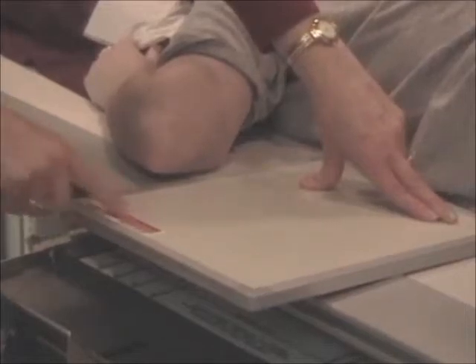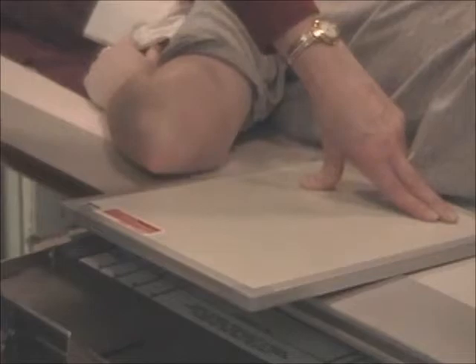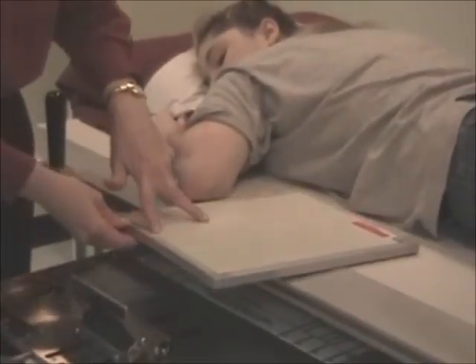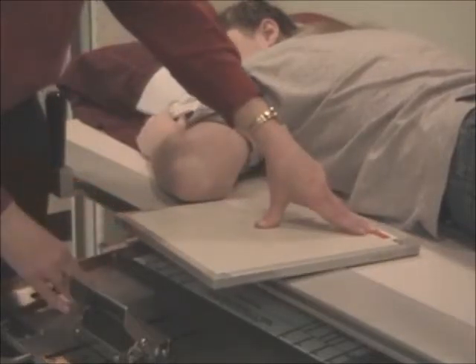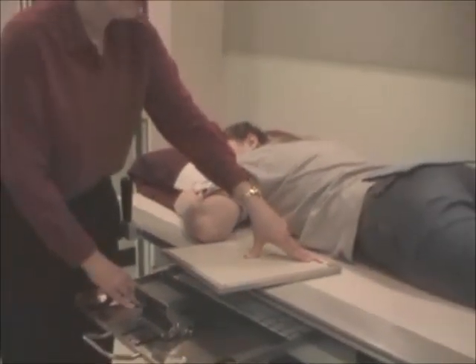So I'm looking at the ID blocker and I'm going, but it might be into the fundus. That's a true statement. It might be into the fundus. So if we reverse the cassette, here's the fundus, circles around to the body, comes over to the pylorus, and now the ID blocker might be into the pyloric region. So you're kind of in trouble perhaps either way.